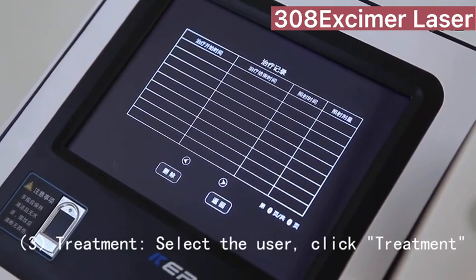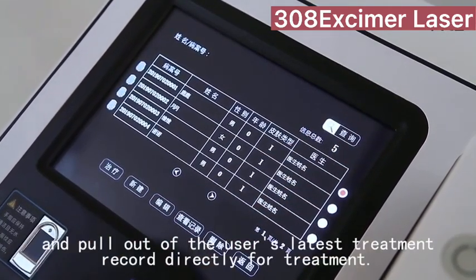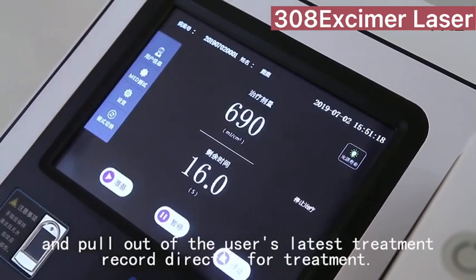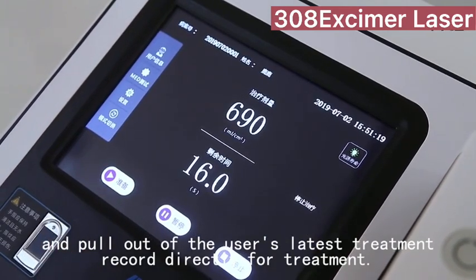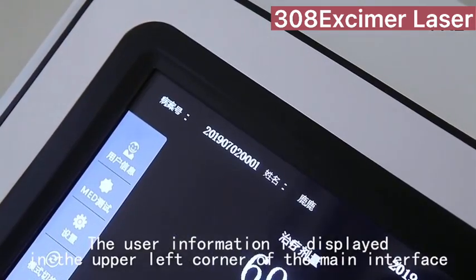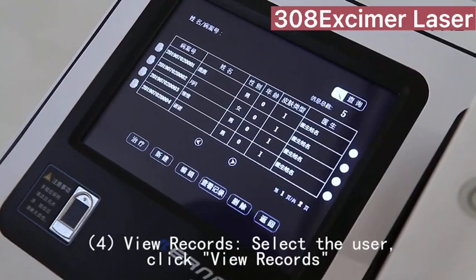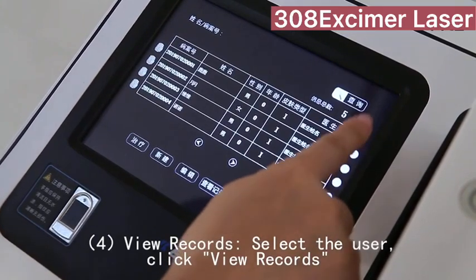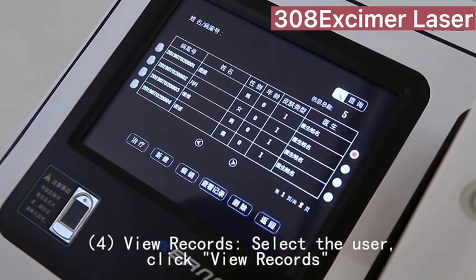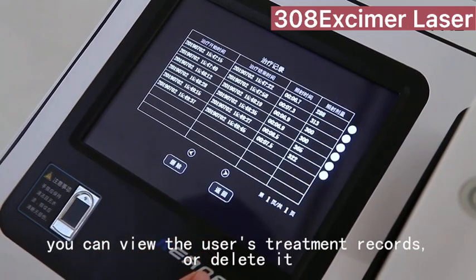For treatment, select the user and click Treatment to pull up the user's latest treatment record for direct treatment. The user information is displayed in the upper left corner of the main interface. To view records, select the user and click View Records to see the user's treatment records or delete them.